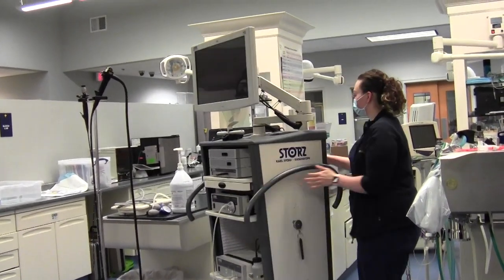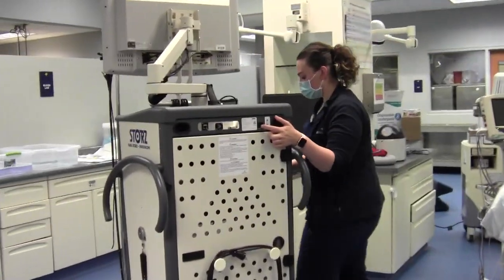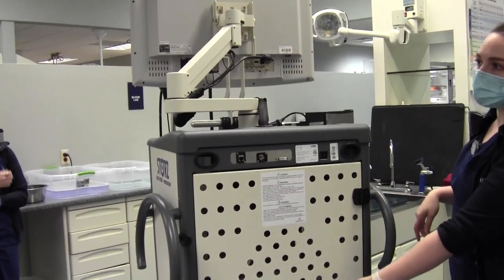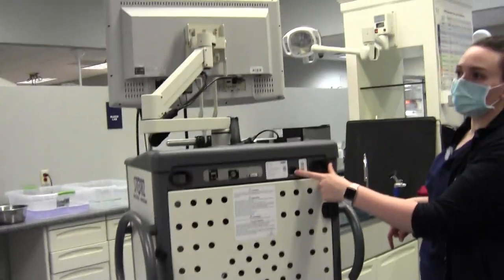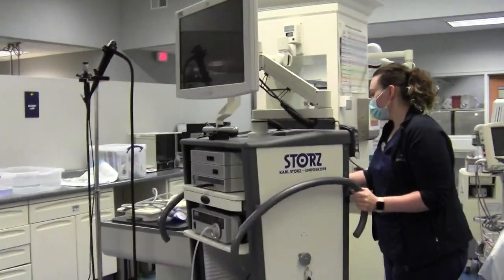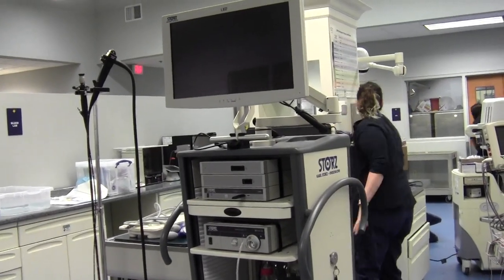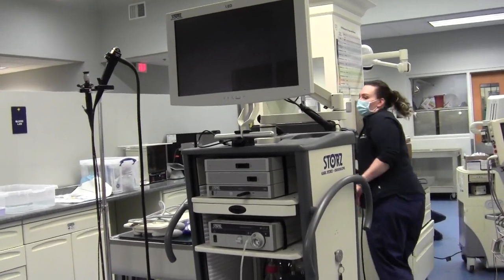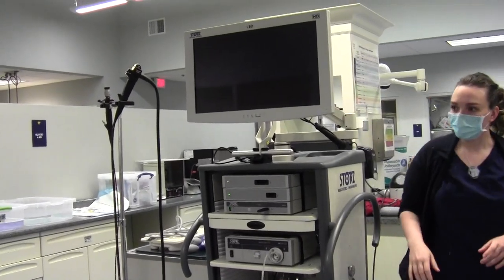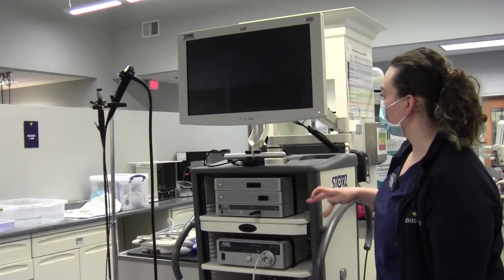On the back of the machine there is a switch button that turns it on and off. You first just have to plug it in and then flip the switch to turn the machine on. It'll start loading and turn the monitor and the computers on.